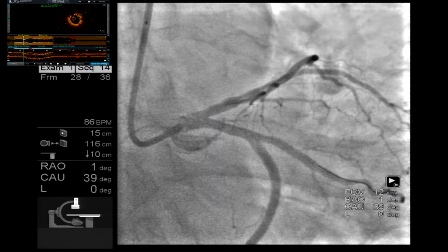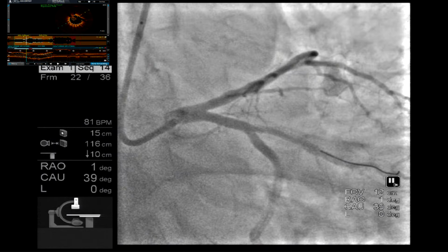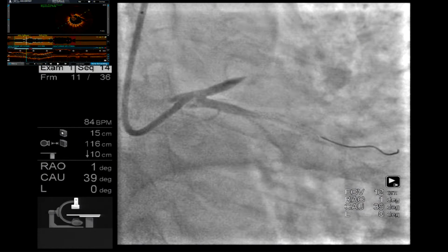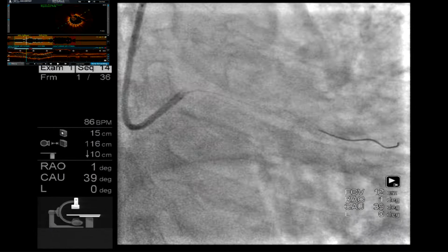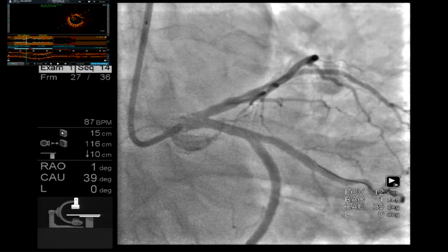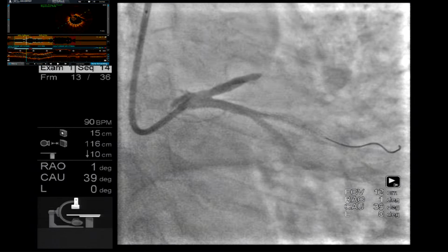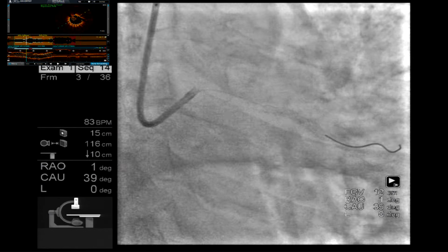Let us focus on how Sanjay makes the banana shape of the balloon. Can we show a close up to this camera? He has threaded the balloon on the wire, and now he is giving shape to the wire. So the balloon shaft inside the tube will take that shape. The wire is distorted, but we don't worry because that part we don't worry in any case. So the balloon has that banana shape.